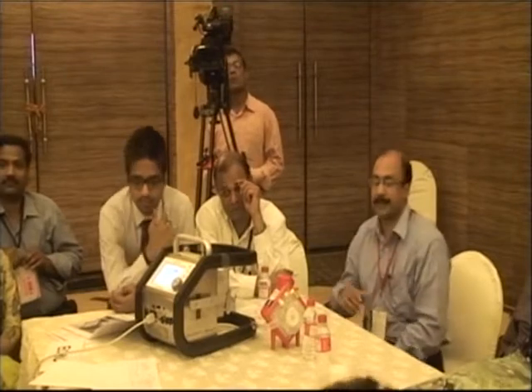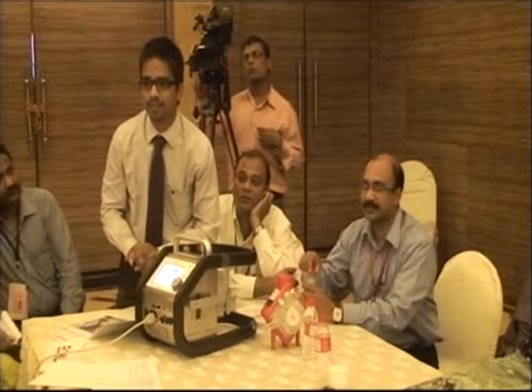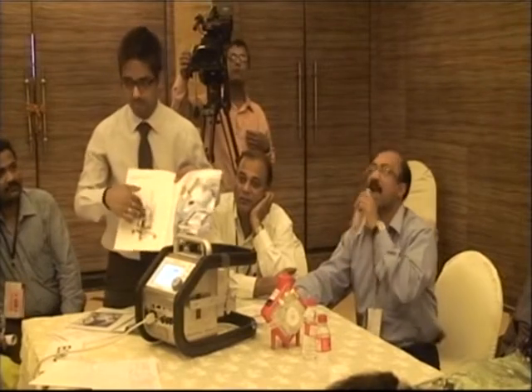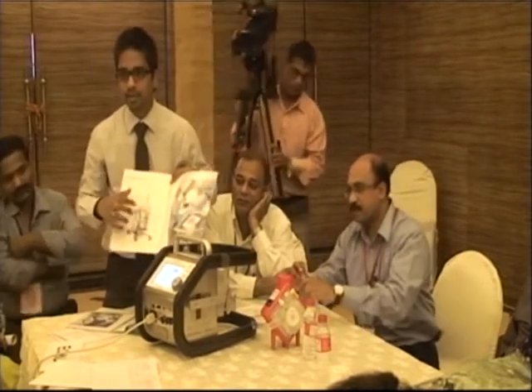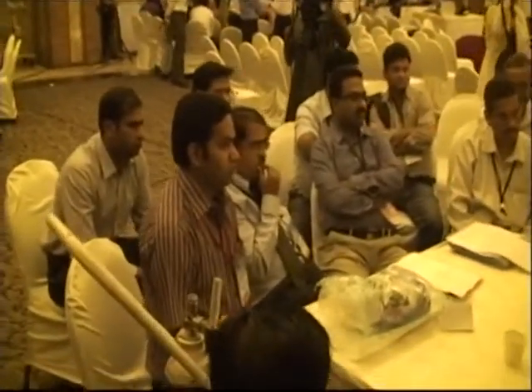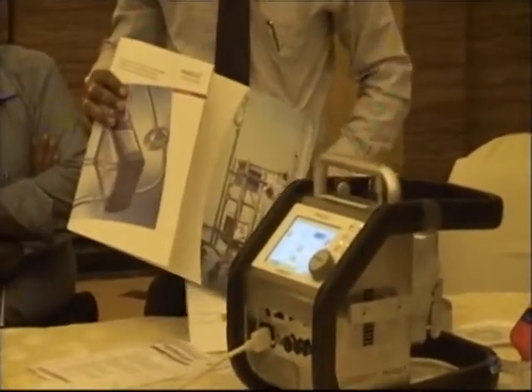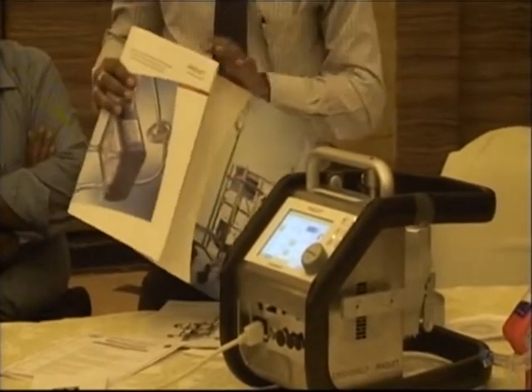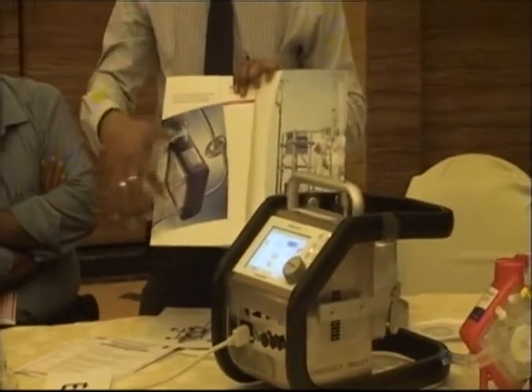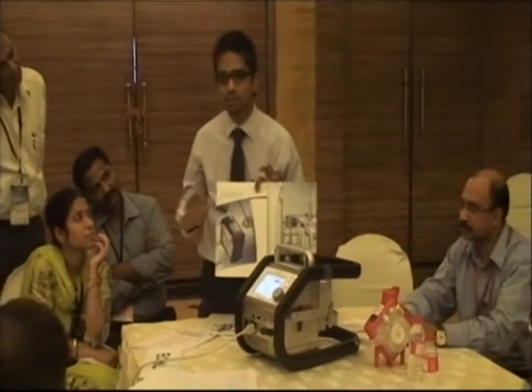The price of it? I'll just tell you about the machine first and then I'll get on. Price of the machine? Okay. It consists of the pump, a heater unit which maintains the temperature, and the air oxygen blender and everything. This costs around 45 lakhs. That's the second generation machine. The first generation machine is a little bigger comparatively and has fewer monitoring features, and costs around 30 lakhs. But the disposables of the first generation machine cost around 1.5 lakhs per patient. So this works for 30 days.